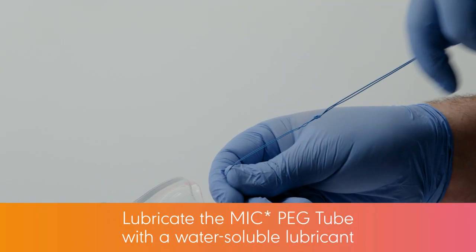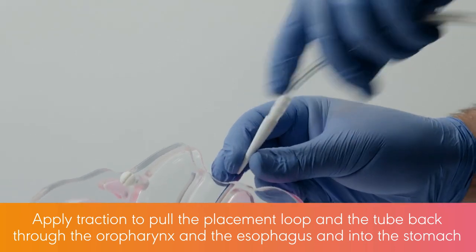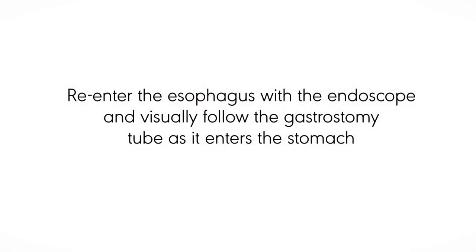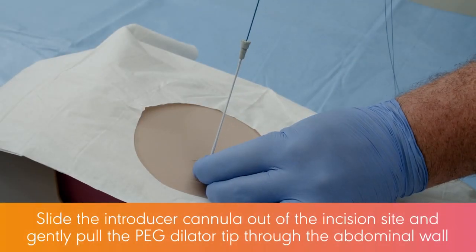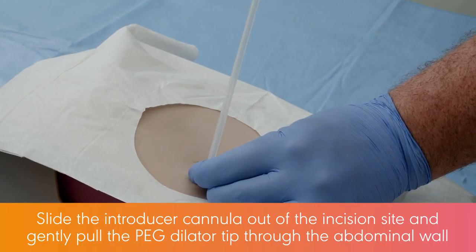Lubricate the MIC-PEG tube with a water-soluble lubricant. Apply traction to pull the placement loop and the tube back through the oropharynx and the esophagus and into the stomach. Re-enter the esophagus with the endoscope and visually follow the gastrostomy tube as it enters the stomach. Slide the introducer cannula out of the incision site and gently pull the PEG dilator tip through the abdominal wall.